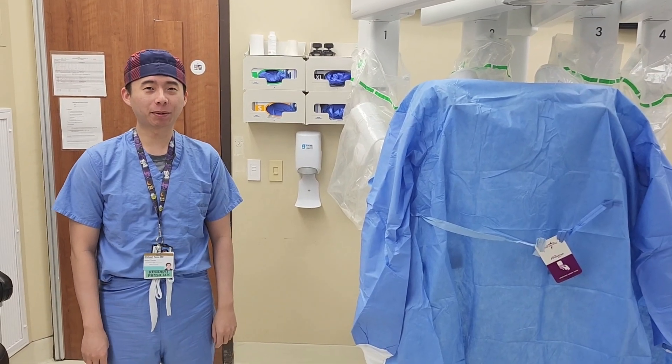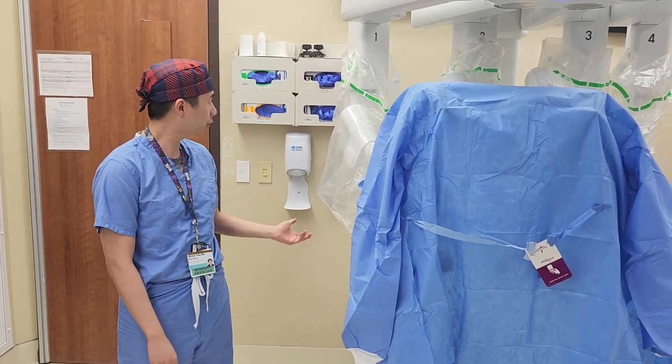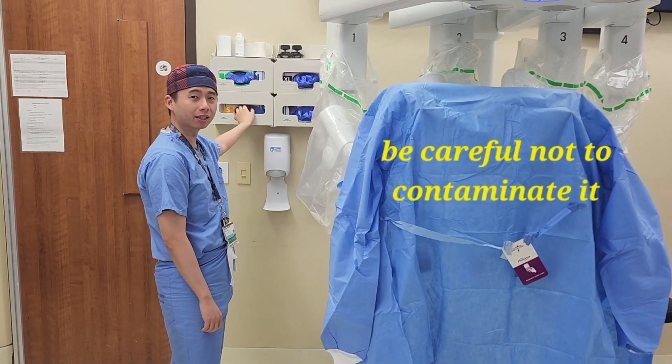We walk into the robot room before the case starts. Typically the robot is draped by the surgical team. When reaching around it — for example, if you're wearing gloves — try not to contaminate it when reaching around it.